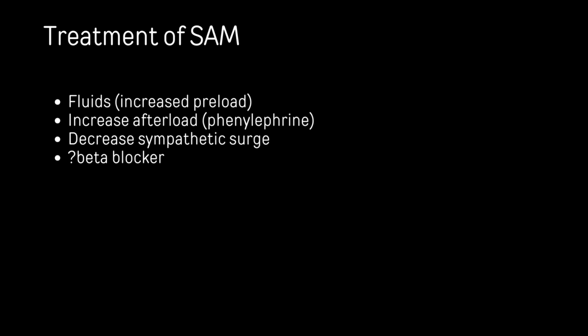So it's just something to be aware of and think about. Why are the adrenaline requirements going up on this patient, and it's just getting worse the more adrenaline I give? It might be that there's a SAM.